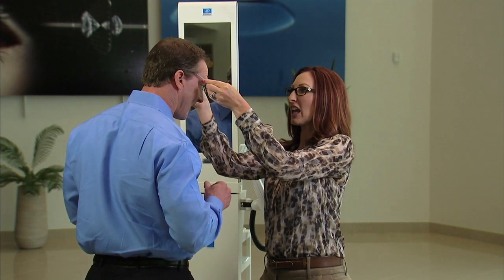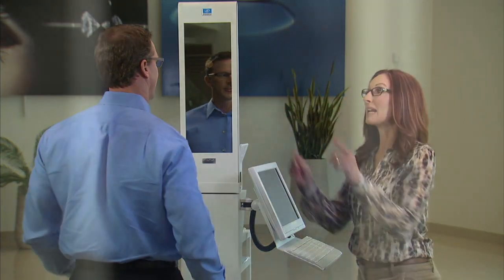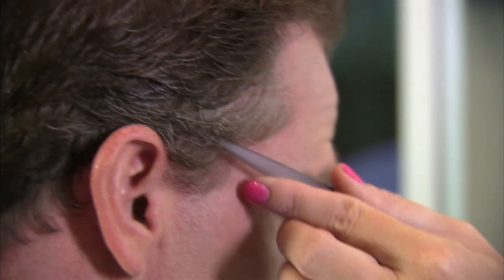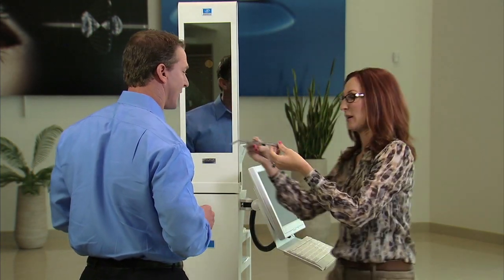Before attaching the frame clip, pre-adjust the frame to the patient's position of wear, ensuring correct position of the nose pads and temples. The patient must be measured with the frame he or she will be using. For multiple pair sales, a new measurement file will be created for each pair selected.